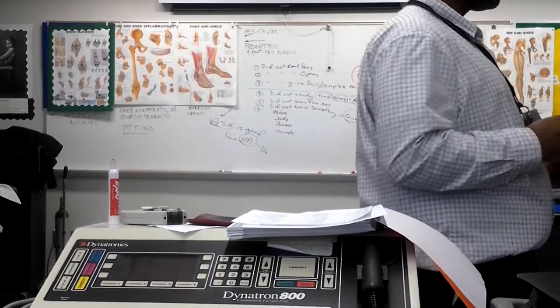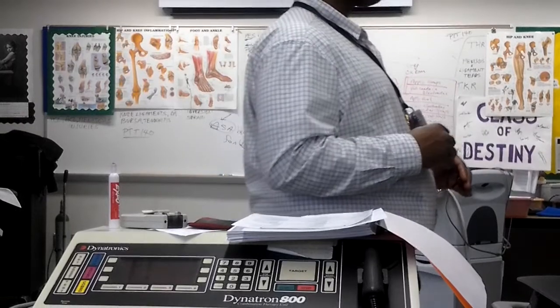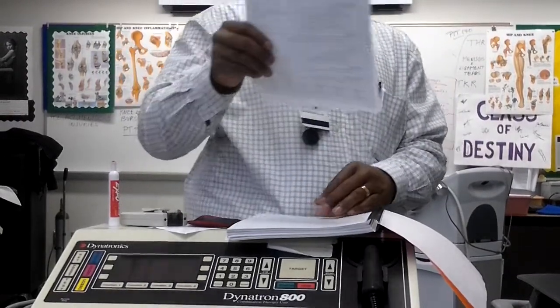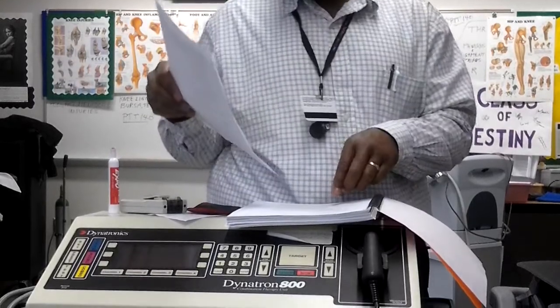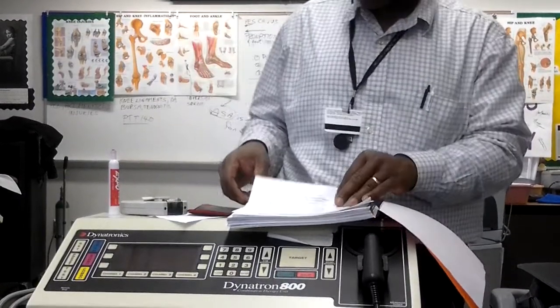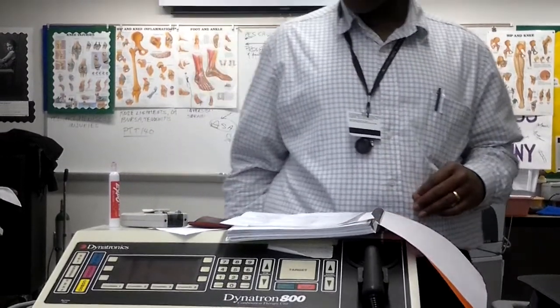Conventional TENS is the same as the acute pain protocol TENS. It's on page 2. At the bottom, low rate TENS. And that's the chronic pain protocol. Chronic pain. Okay, the gate pain theory.